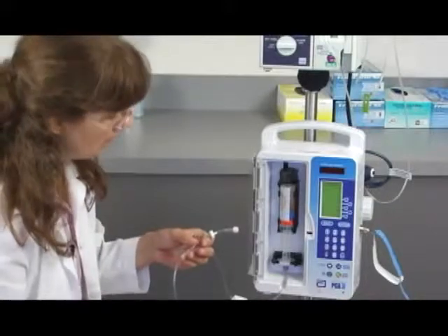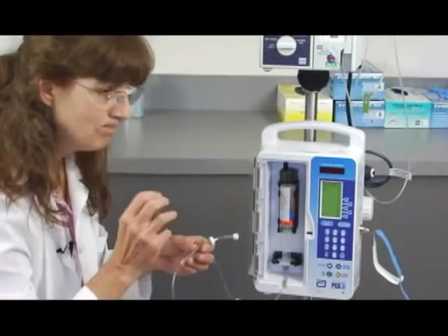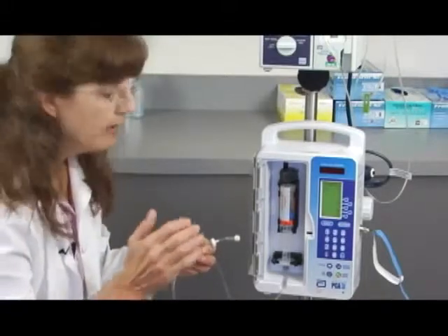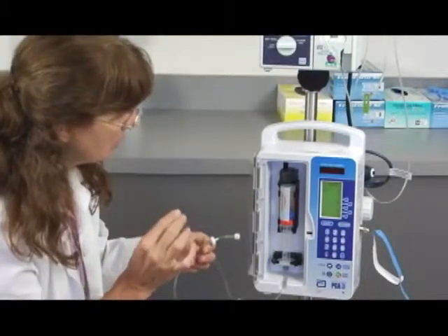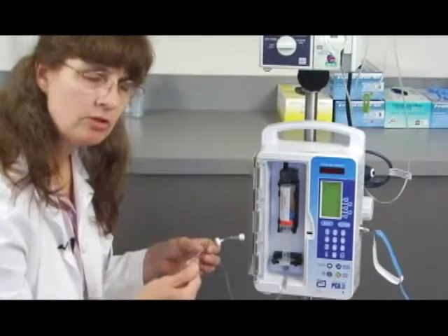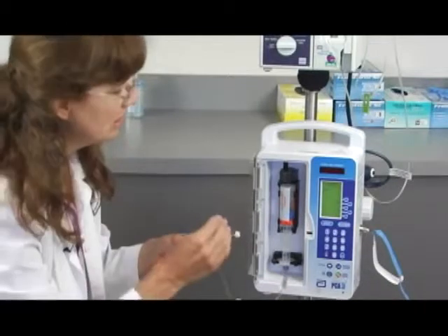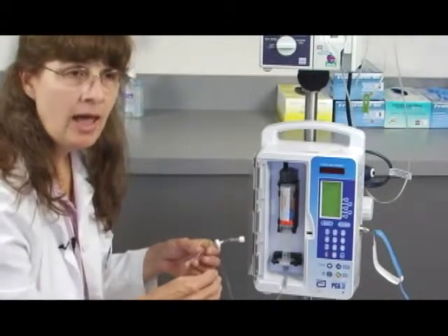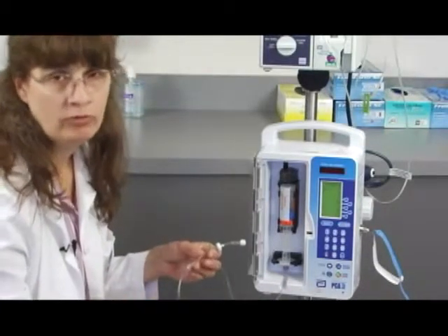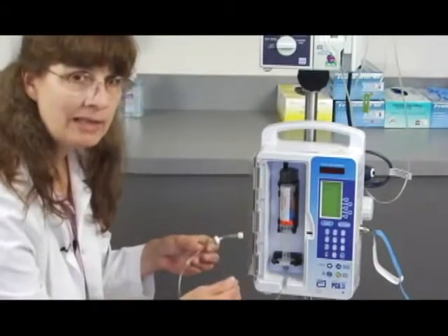Purge can also work to take out any little tension or slack in the system. Because sometimes when you administer the first dose of the PCA, there's a little slack in the system and the patient won't quite get a full dose.